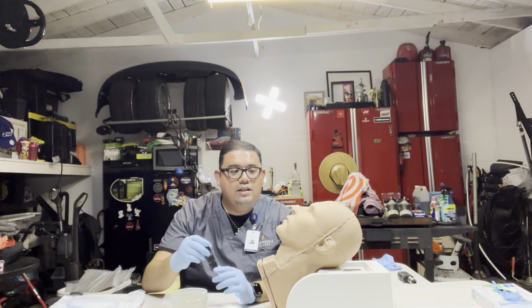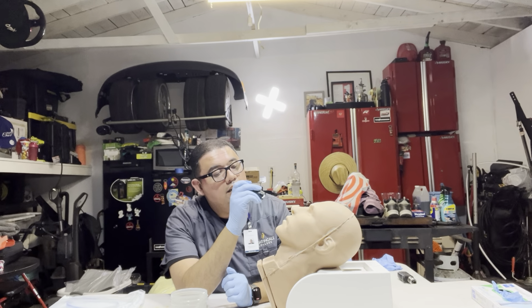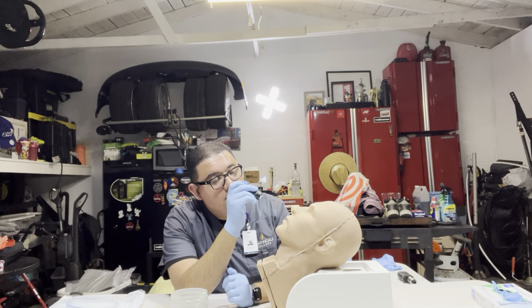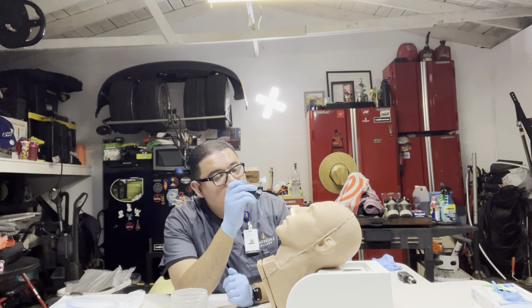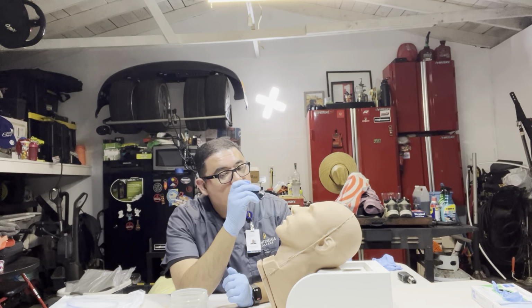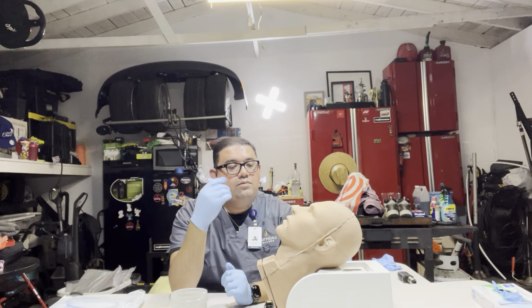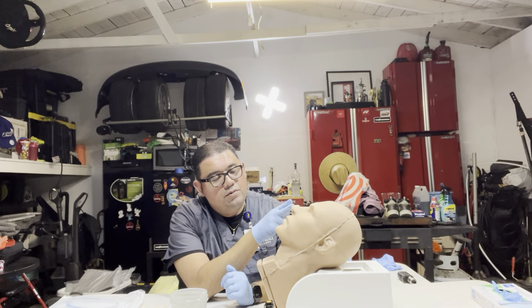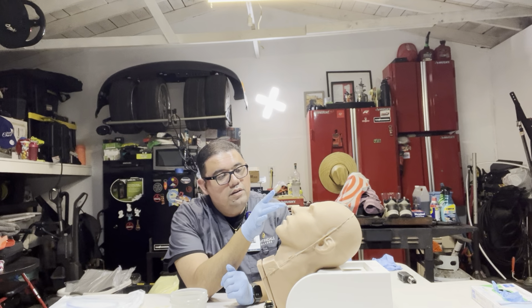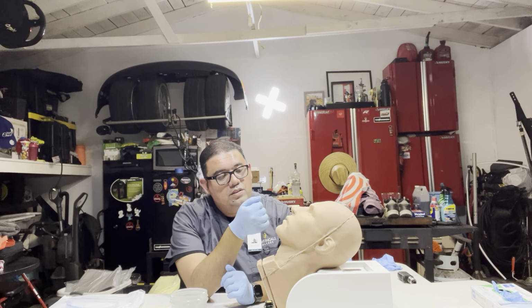Mr. James, I'm gonna go ahead and inspect your nostrils. I'm gonna look for any abrasions, deterioration in each of your nostrils, any deformities noted. We look good on both sides. Then I'm gonna have you, Mr. James, breathe normally. I'm gonna feel for any air flow and which nostril is more appropriate to insert the tube in. I'm going to insert it into your right nostril, which is more patent.